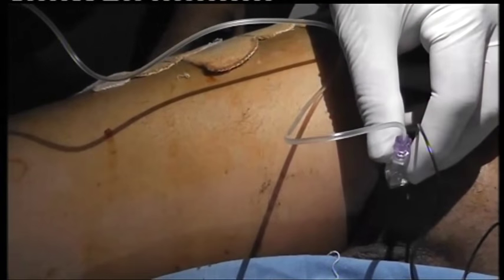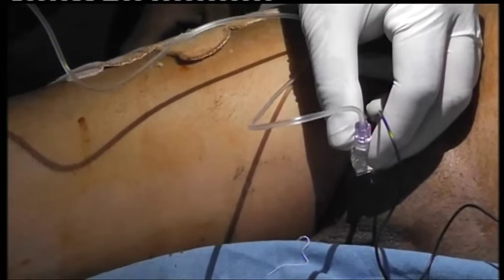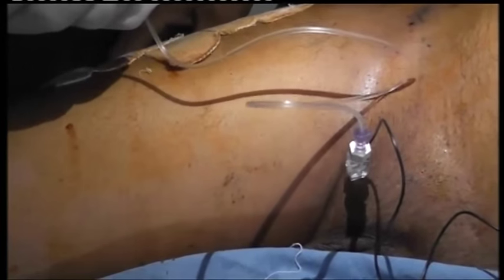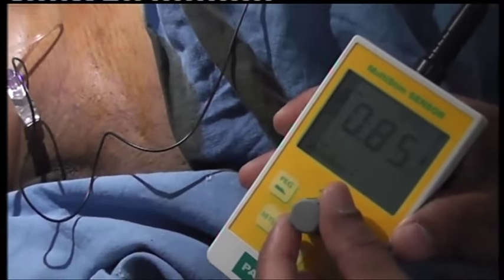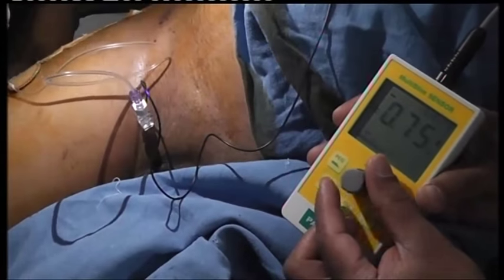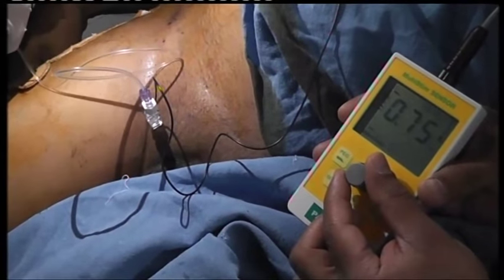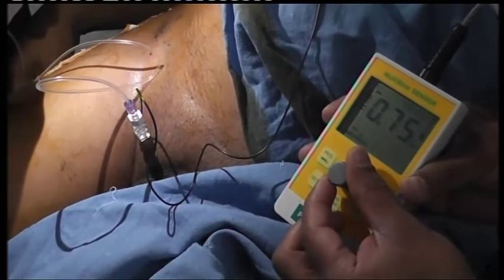Can you see the adductor response? Yes. So you've got the adductor muscles. We'll reduce the current now. That is 0.85 — reducing the current. We started with 1.5 as usual. 0.8. I can still feel it under my hand. Go down to 0.5.